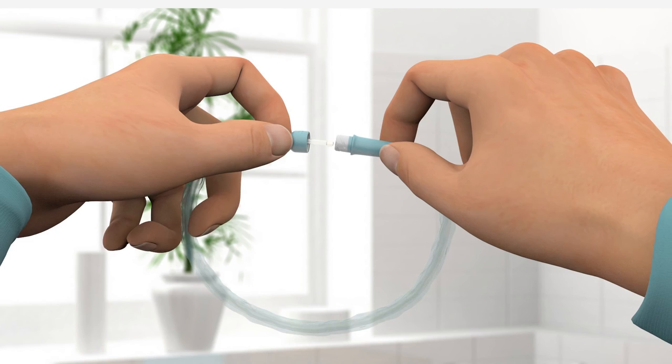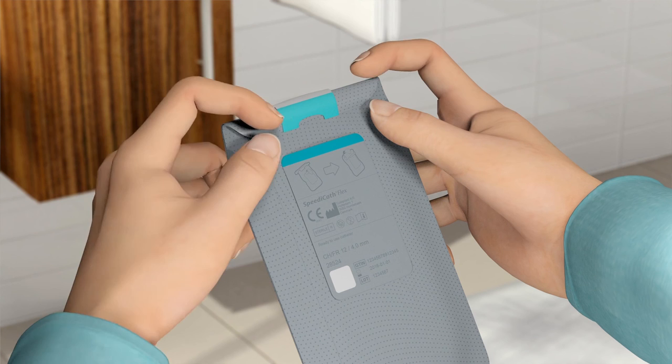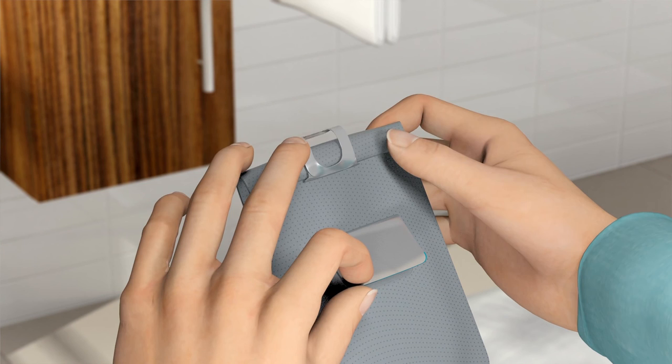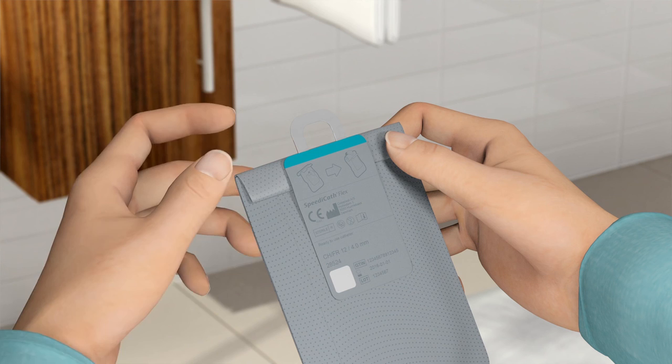Twist the lock to seal the catheter. Then put the catheter back into the packaging and close it by folding the flaps and sealing with the sticker. You can dispose of the catheter and the packaging in your household rubbish. Do not flush it down the toilet.